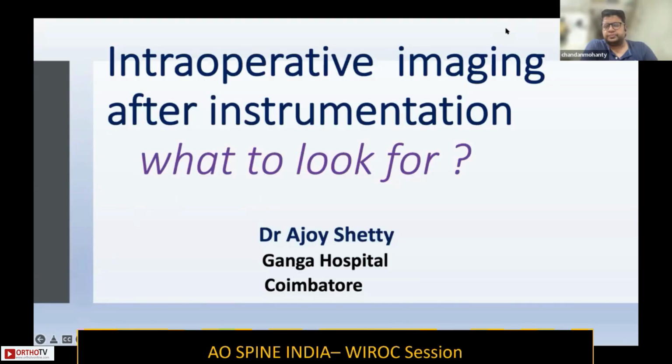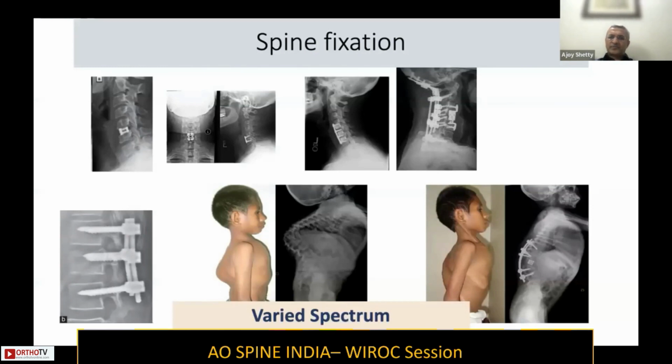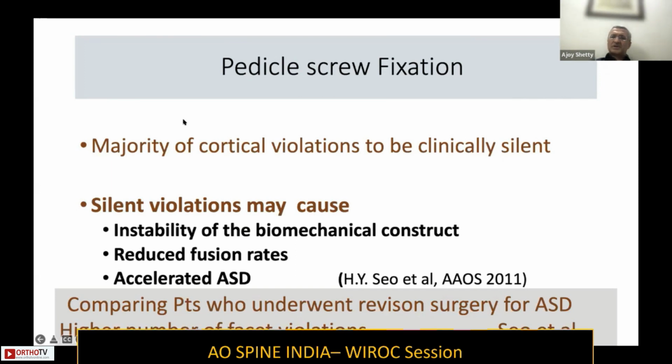I will be speaking on intraoperative imaging after instrumentation, and what to look for. So far, you have heard about various fixation options in spine surgery, which is a varied spectrum, and you have also heard talks about how to do it right. However, we know that pedicle screw violations do happen, but fortunately, the majority of these violations are clinically silent.